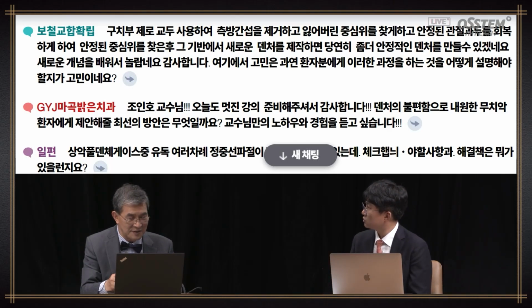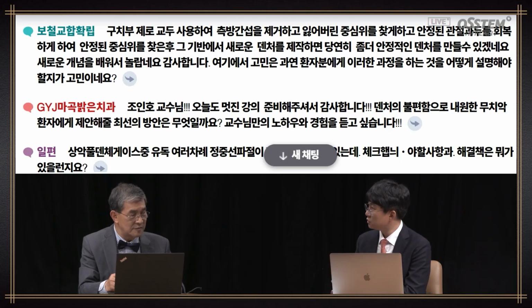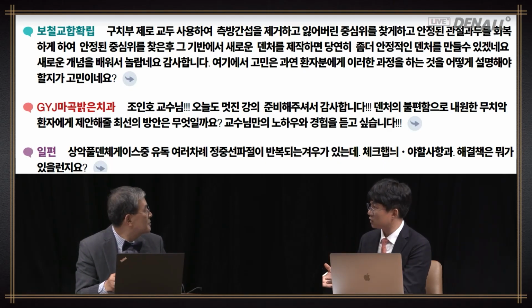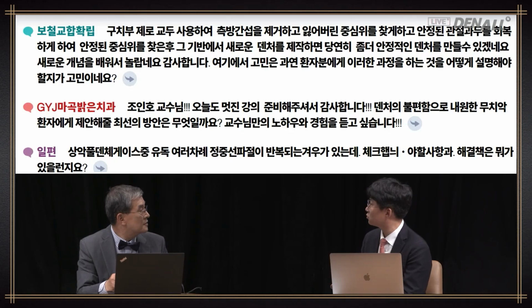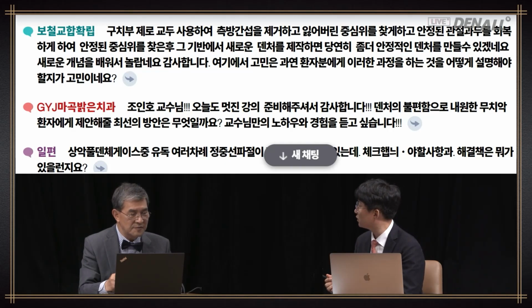I think there is some misunderstanding here. I don't use 0-degree cusp teeth. People think it is used to chew at any position when the lower denture is not stable. But we know in the TMJ there are condylar angles and the Christensen phenomenon. Therefore, bilateral balanced occlusion is really hard to achieve in many cases. So I use the lingualized occlusion for those with some gap.